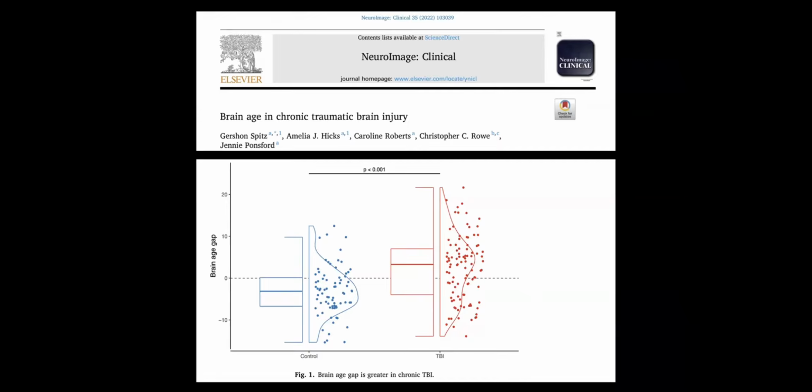And if the brain age looks older than the chronological age, we have a positive brain age gap, which means we have accelerated or abnormal aging. If, of course, the brain age is about the same as the chronological age, then there would not be a brain age gap and there would not be accelerated aging. And it is theoretically possible for people who have really good, healthy lifestyles to even have a negative brain age gap, which means that you're aging in reverse or you're decelerating your aging. Although, unfortunately, with most pathological conditions, we would expect to see an elevated brain age gap.